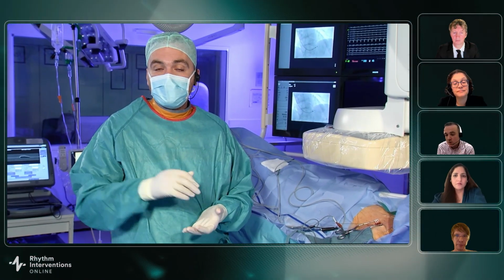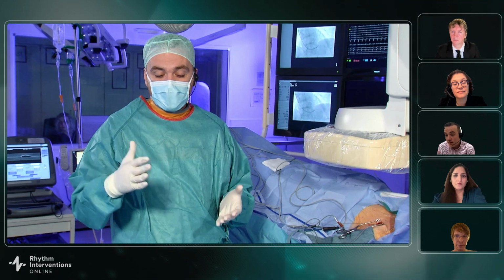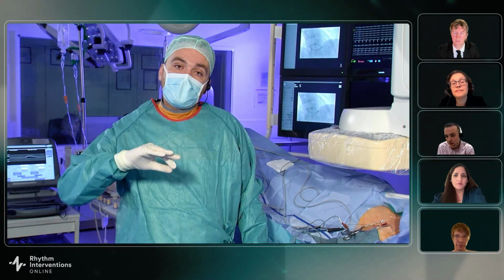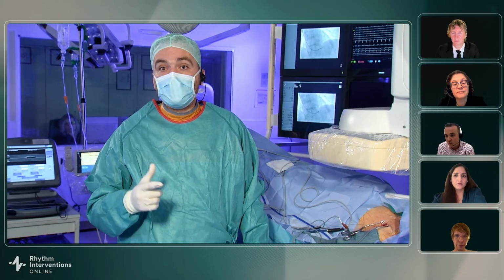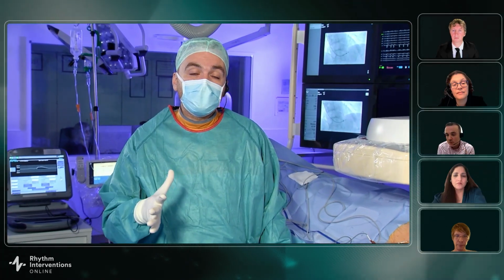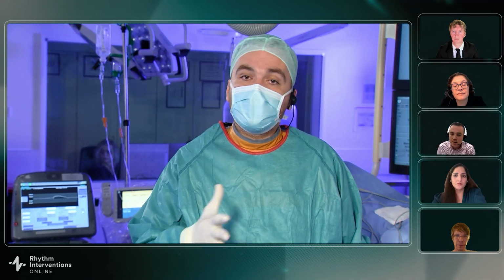And when I see a fixation beat, I will go slow. Then if I have a terminal R in V1, I know that I'm pacing from the left side. The question is: do I pace only the muscle, or am I pacing the left bundle? So I have to measure the R-wave peak time in V6. Then I can perform my threshold test to see if I have any transition. And of course, we look at the QRS morphology and all other parameters. Maybe I can show you the ECG after implantation.